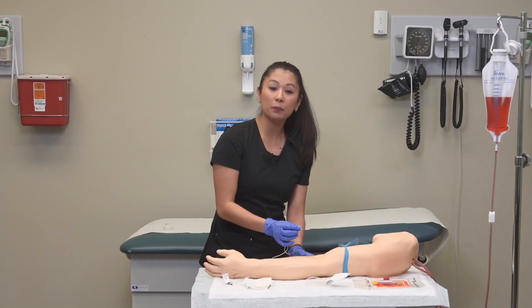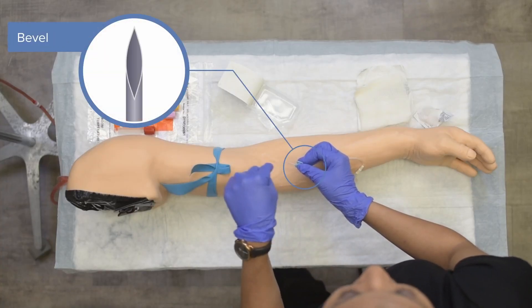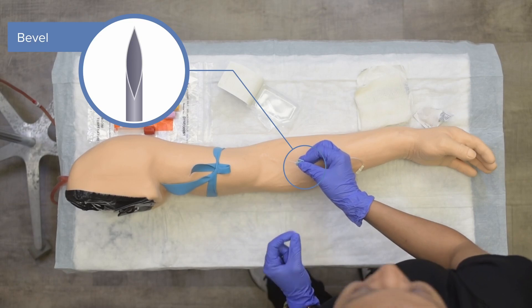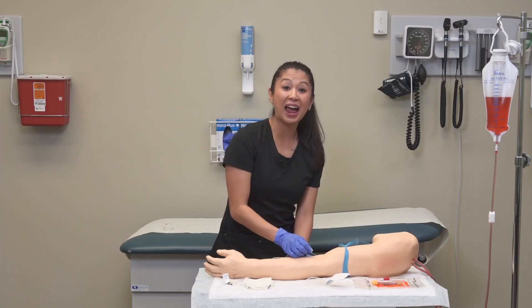When talking about the bevel, if you look down at the needle, you should see the opening or hole of the needle looking up at you. Now, with the bevel up, I'm going to access the vein.